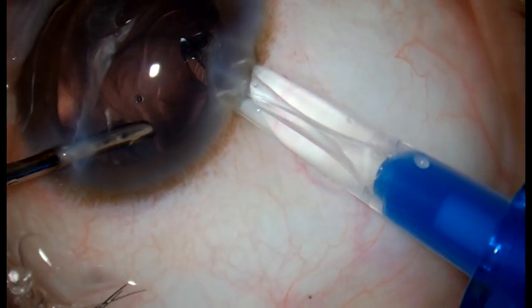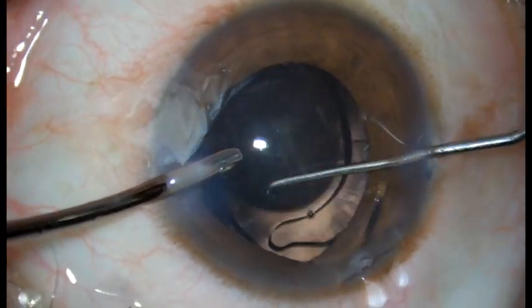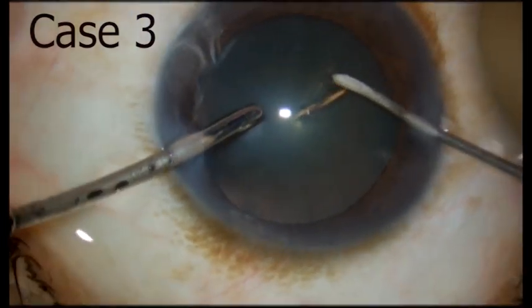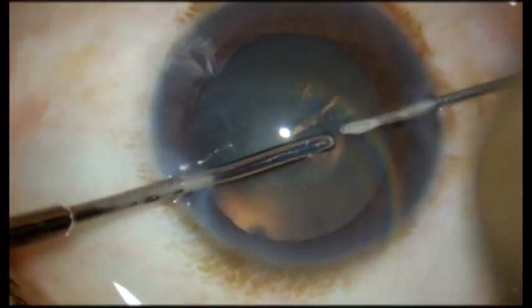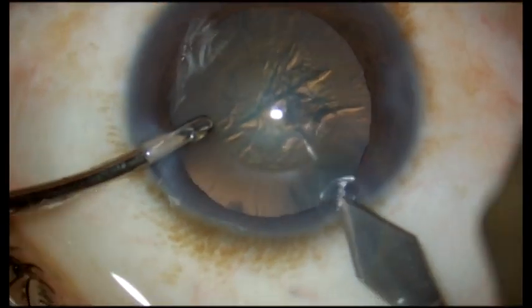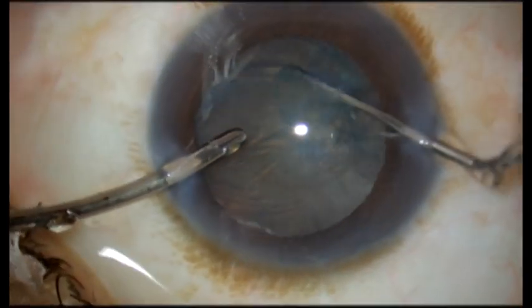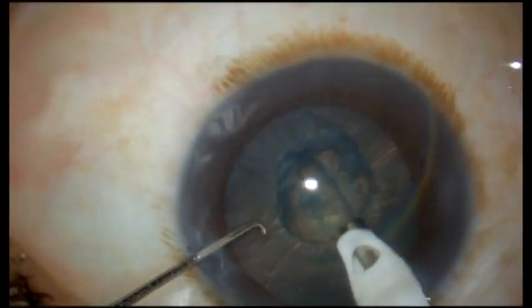In our videos, we are performing all steps of phacoemulsification under continuous irrigation. It is a positive pressure surgery, so there is less chance of post-operative inflammation. Due to positive pressure, there is no chance of ingress of fluid from outside, which avoids possible risk of intraoperative entry of fluid from the conjunctival cul-de-sac and thus avoids infection.